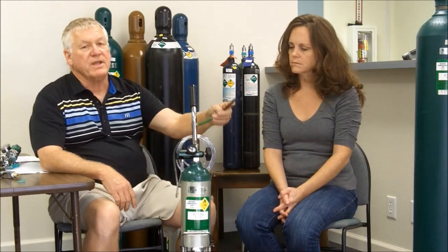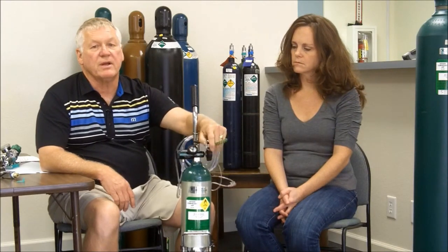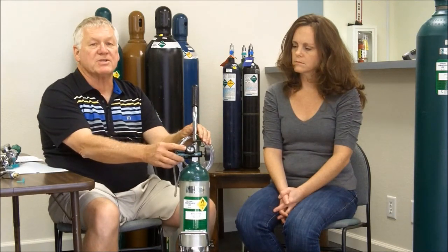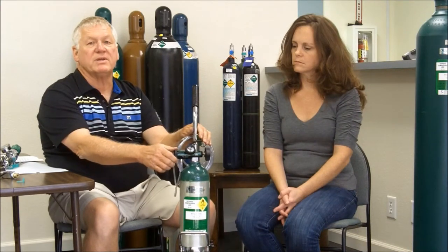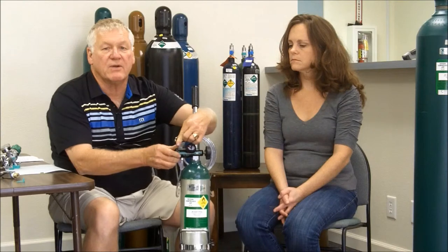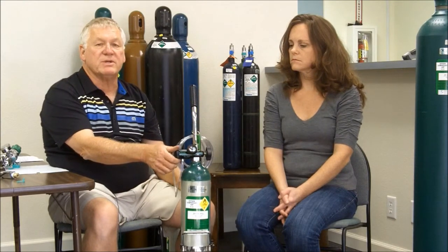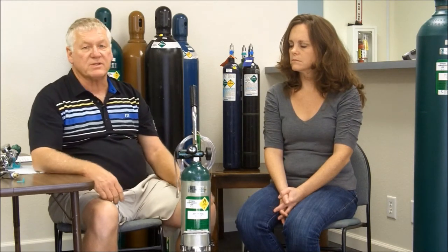So when I go to use it, the first step is to take my wrench, put it on top of the cylinder, and rotate it counter-clockwise. I look at my gauge — it'll tell me how much oxygen I have — and I'll then select the flow I need for the desired piece of equipment. When I'm done using it, I turn it off by going clockwise, open the flow control until the contents gauge reads zero, then turn the flow control off. And that's how I'll store my cylinder.